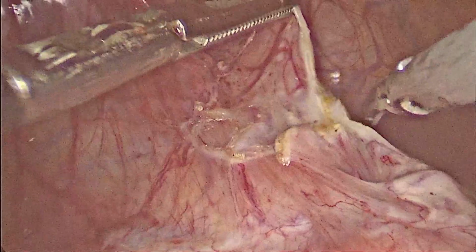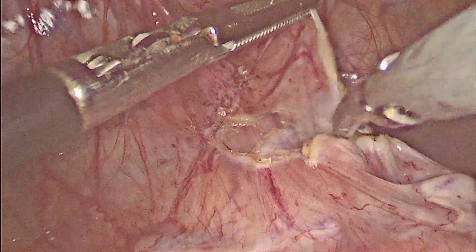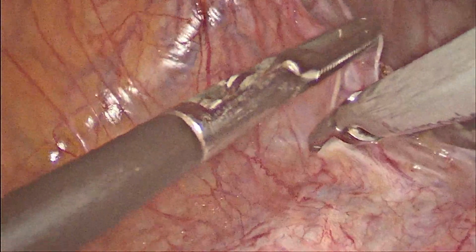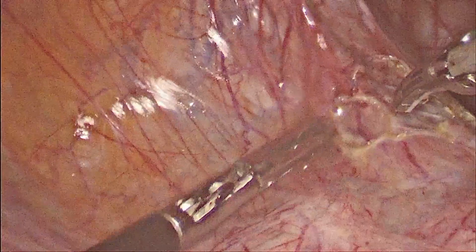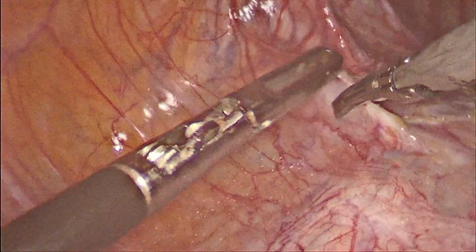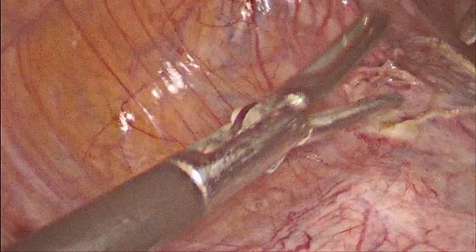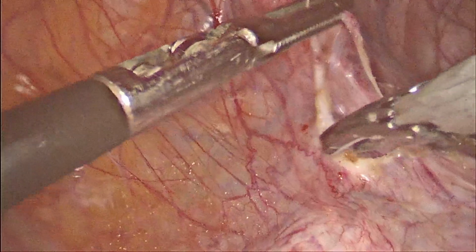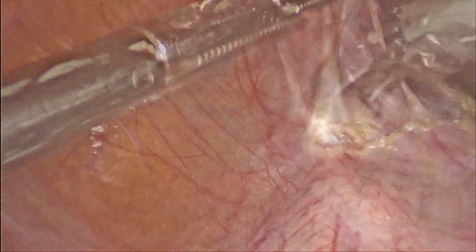In this case, we use the anterior approach, as there's a thick band of fibrosis between the uterovesical fold of peritoneum and the scar. As we are aware, scar pregnancy happens at the site where there is poor healing of the scar. So we should anticipate a dense fibrous tissue between the bladder, uterovesical fold of peritoneum, and the scar area.